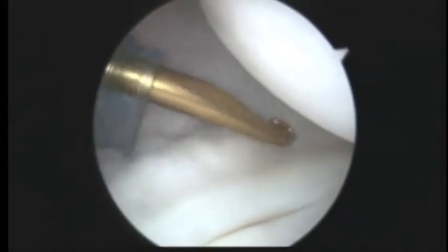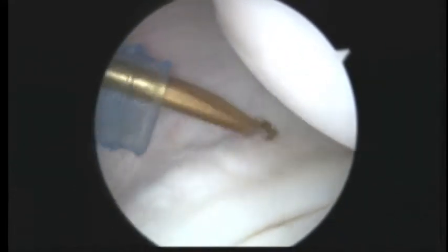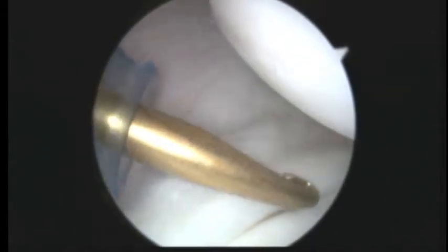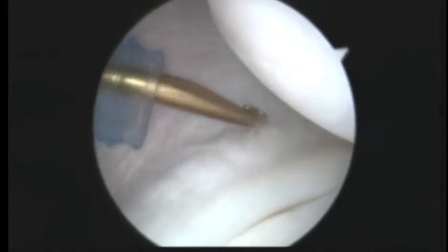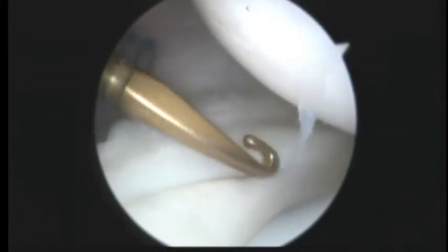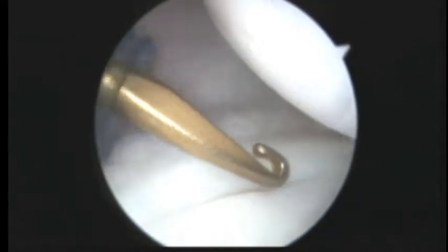Now this is the posterior band of the inferior glenohumeral ligament, right where I'm touching. And this is something that we'd like to tighten up here to try and stabilize the shoulder a bit more. Your instability was actually more towards the front once we had you under anesthesia, but you had a definite posterior component to it. So as I tug on the labrum here, this actually feels pretty stable. So I think we'll be able to use that as an anchor.